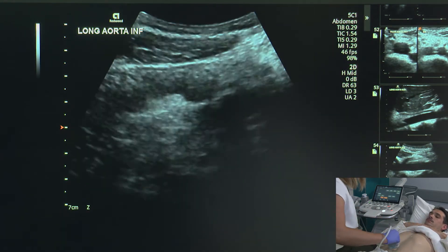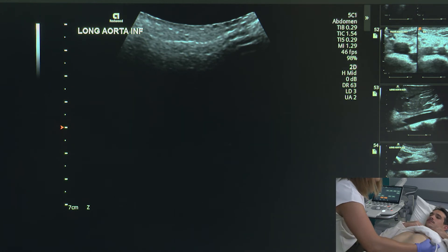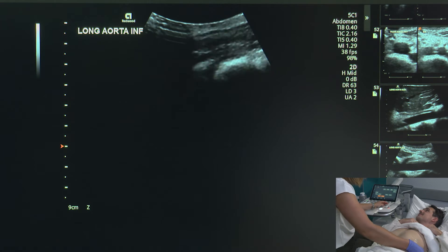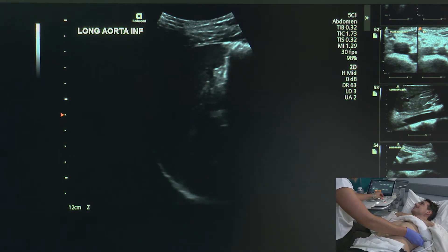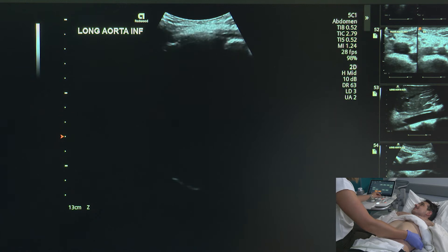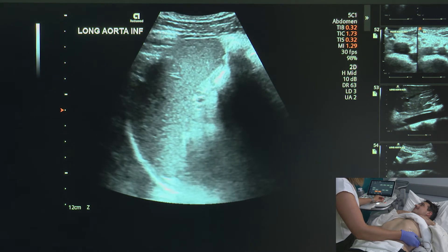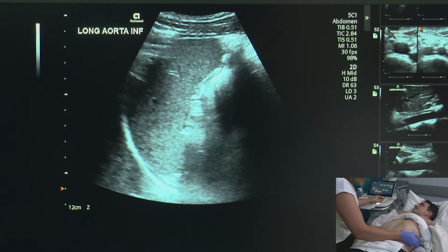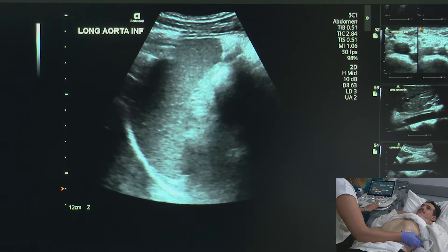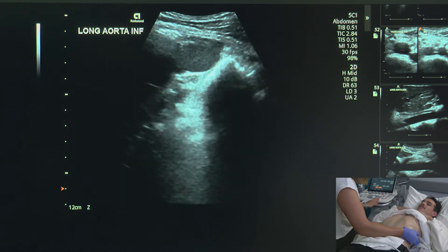Now we're going to move on to the spleen. When we go to image the spleen, I'm going to start with my patient in supine just to see how it looks. I can see that tip of the spleen — I'm currently in the longitudinal plane for the spleen. I'm going to make sure that my gain is set appropriately so I can see it nice and clearly. I feel as though I can see the spleen quite well. I'll adjust my focus and then start my sweep, angling through those ribs and coming all the way down and back up through that splenic tissue.